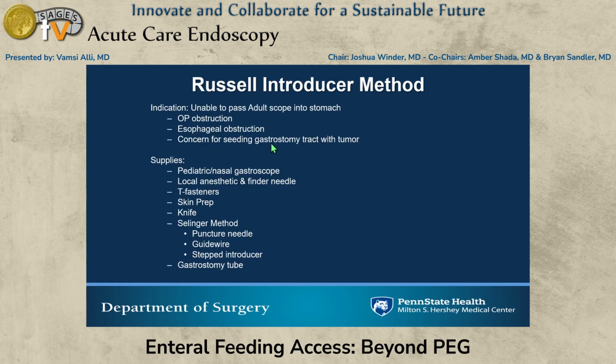Reasons why we would do this: unable to pass an adult scope into the stomach. If you have a patient with head and neck cancer or esophageal cancer and a very narrow esophageal lumen, you may not be able to pass the standard bumper from a traditional PEG transorally. And if you have concerns over potential seeding, you need a small caliber scope.